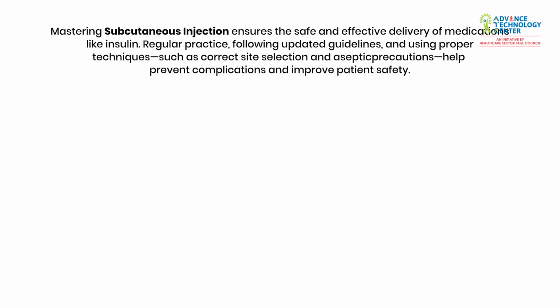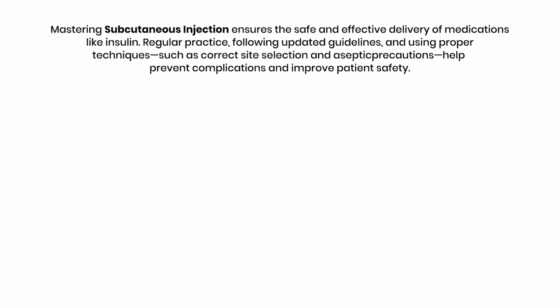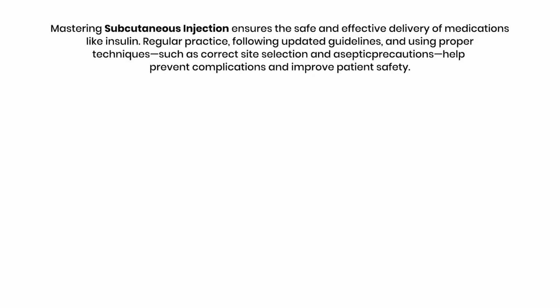Mastering subcutaneous injection ensures the safe and effective delivery of medications like insulin. Regular practice, following updated guidelines, and using proper techniques, such as correct site selection and aseptic precautions, help prevent complications and improve patient safety.